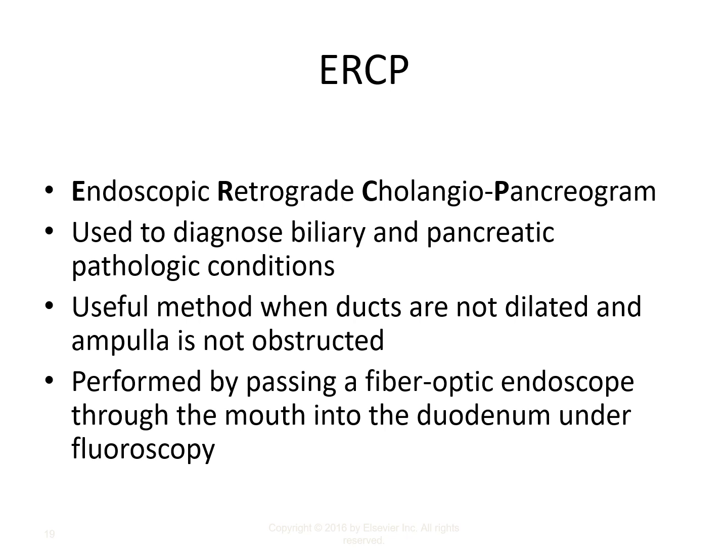All right. An ERCP, endoscopic retrograde cholangiopancreatogram. Sometimes these are done in the fluoroscopy procedure table room. You know what I'm saying? Fluoroscopy room. Other times these are done remotely in the OR or similar room outside the department with a mobile fluoroscopic C-arm. So depending upon your facility is how you will encounter your ERCP.